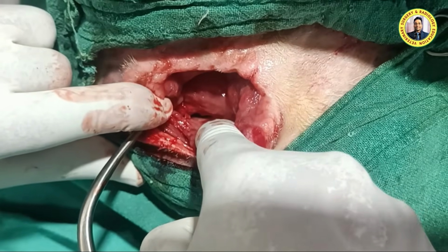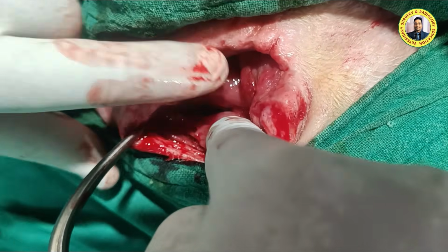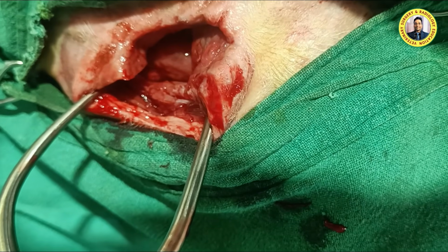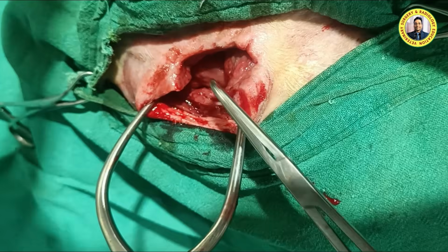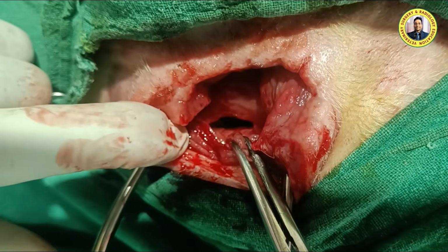So now you could see this is the opening. This is the opening, now you could appreciate this opening. This is the opening which is going, now you could see. So this is the opening.